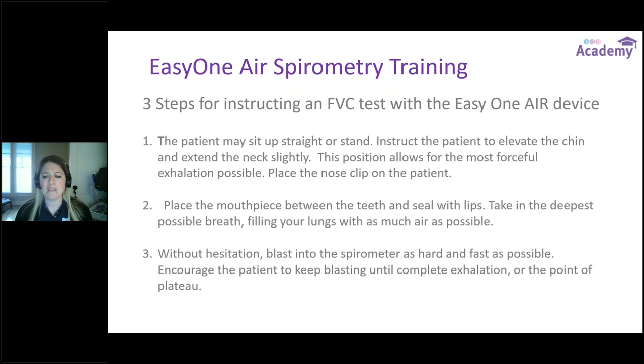Instruct the patient to make a good tight seal, take the biggest deep breath in possible, filling the lungs with as much air as possible. Then, without hesitating, have them blast their air out hard and fast into the spirometer. Encourage the patient to keep blasting until a complete exhalation has occurred — to the point of plateau — when the device senses no more air is coming out of the patient's lungs.